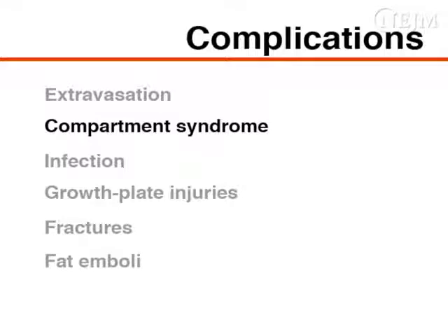Introduction of skin flora or other pathogens can lead to infection at the insertion site, within the soft tissue, or in the bone. Using proper aseptic technique and limiting the time the intraosseous catheter is in place can minimize this risk. Prophylactic antibiotic therapy is not routinely recommended.